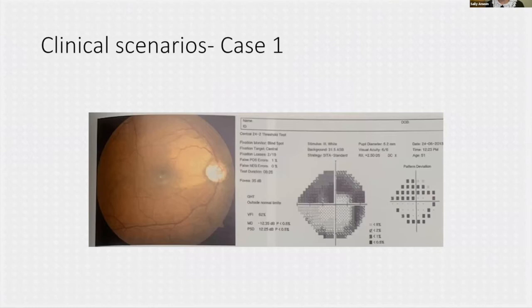And as we go on through these clinical scenarios, just to give you an idea about reality versus textbook, and then we'll talk about them as we go along. So that's just your classic inferior loss of rim, superior loss of visual field, and essentially advanced disease.